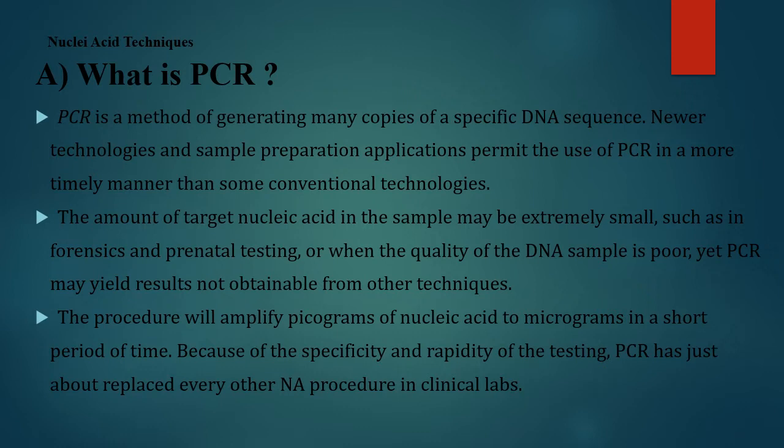So what's PCR? PCR is a method of generating many copies of a specific DNA sequence. Newer technologies and sample preparation applications permit the use of PCR in a more timely manner than some conventional technologies.